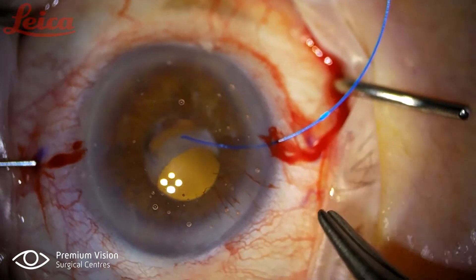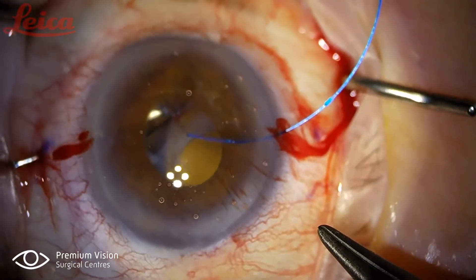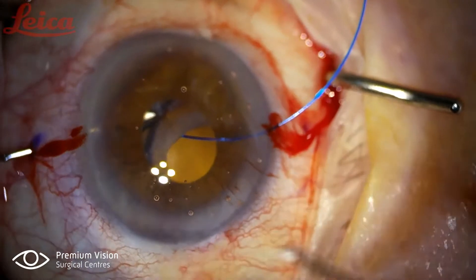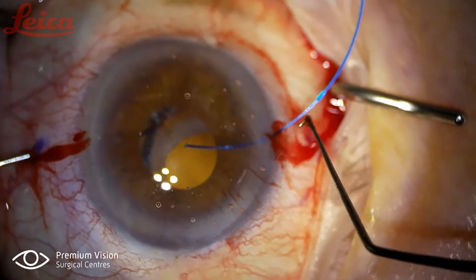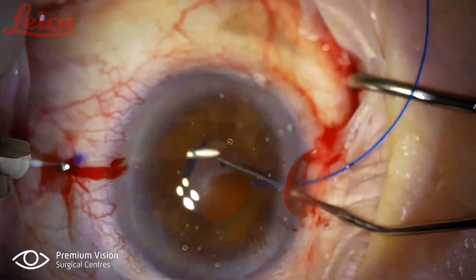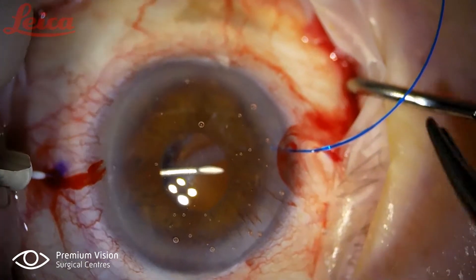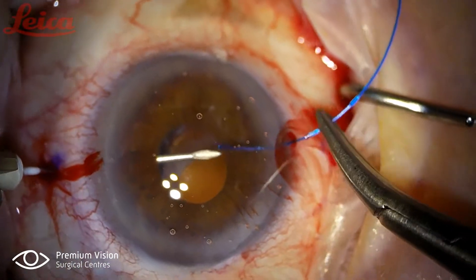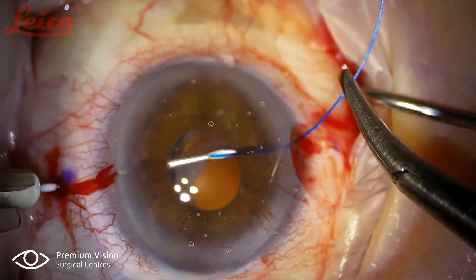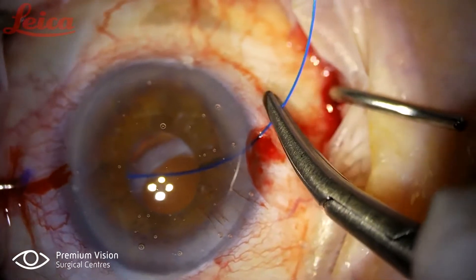The needle I'm using is the thin-wall 30-gauge needle, which I prefer over the 27-gauge as it makes a smaller, clearer pass and means I don't need to make a big flange for the Prolean suture. I entered two millimeters back from the limbus and the first pass is behind the capsule tension ring — you direct the needle into the center of the cavity and then lift the capsule tension ring up. You can see I'm passing the Prolean 5.0 into the hub of the needle and tucking it in until it stops, which creates about 10 millimeters from the tip of the needle.